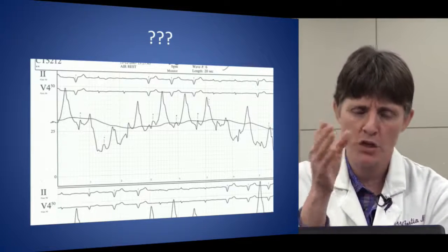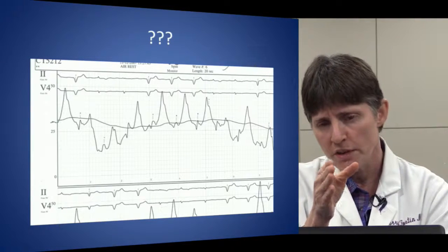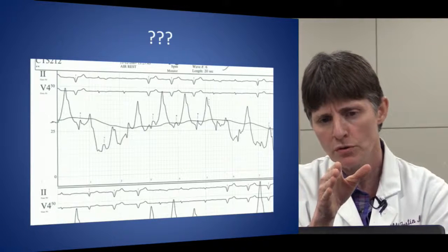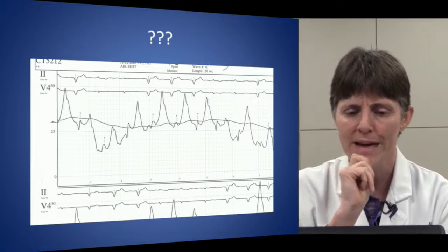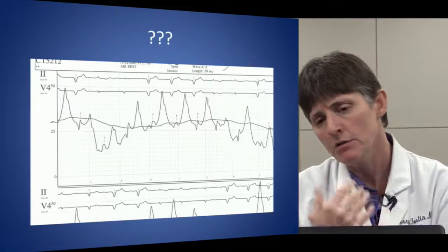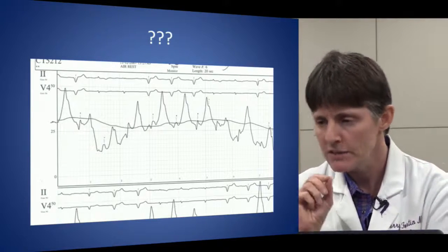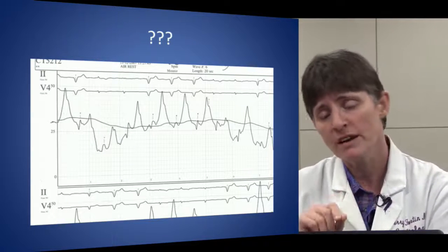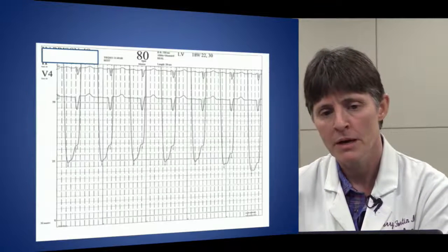So again, if you look at the QRS complexes on the EKG, you see that there's got to be a delay before ventricular contraction happens. So there's an atrial with a little glitch, and then there's a very large V wave. So that V wave is part of the wedge pressure, and it's because this person has bad either mitral regurgitation or some non-compliance of the left side. You need to be careful that you're not in a wedge position and think it's a PA pressure or vice versa. You keep thinking, I'm not wedging the catheter, and I am.